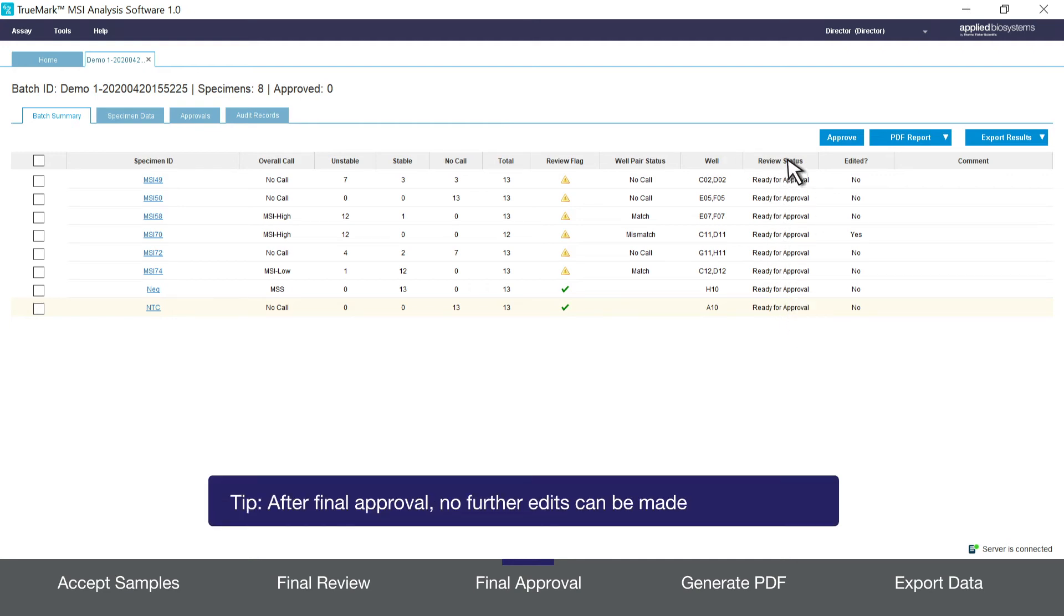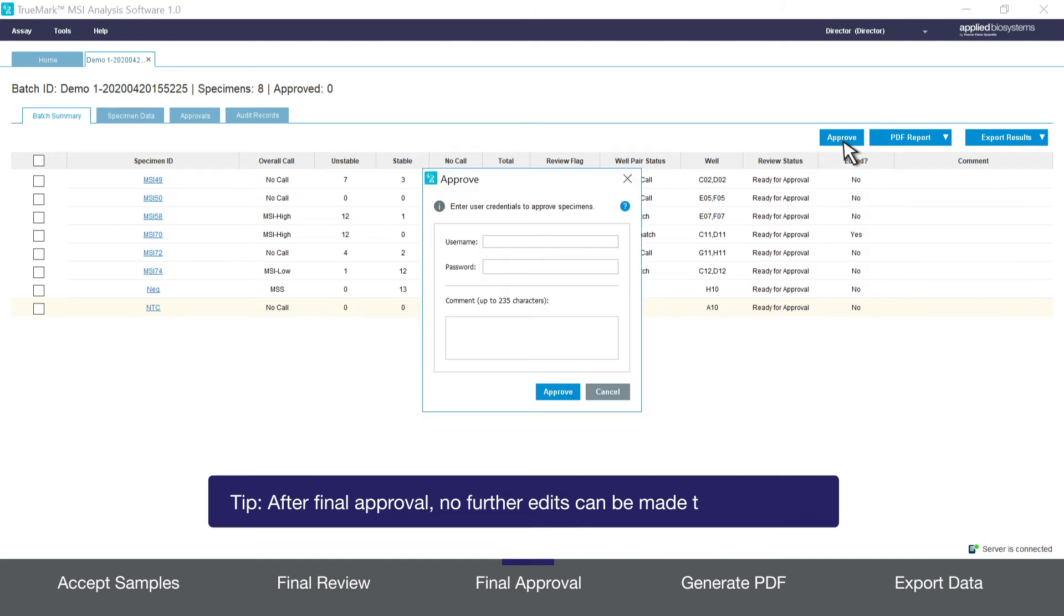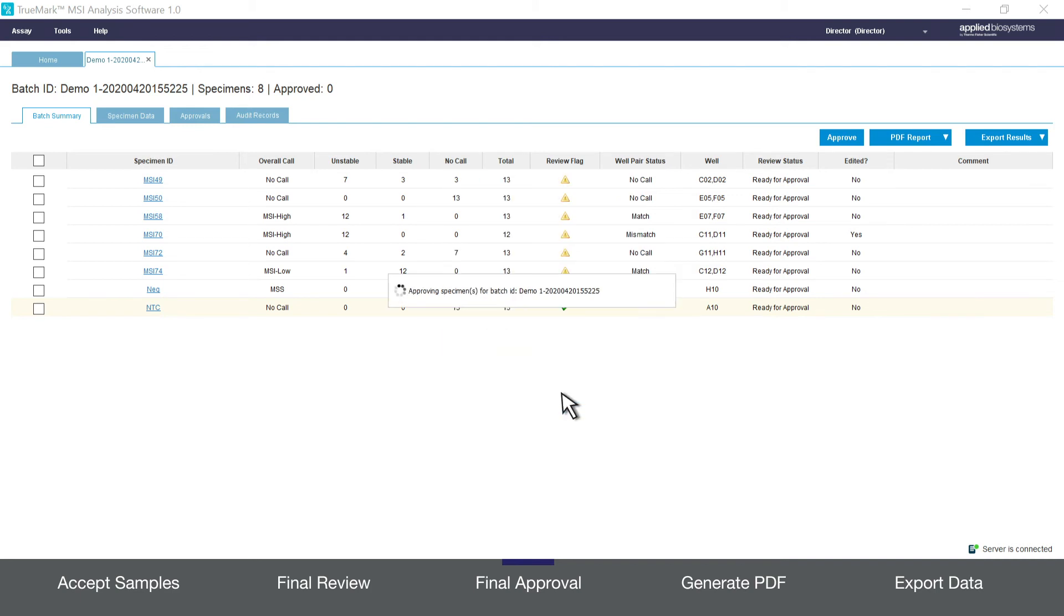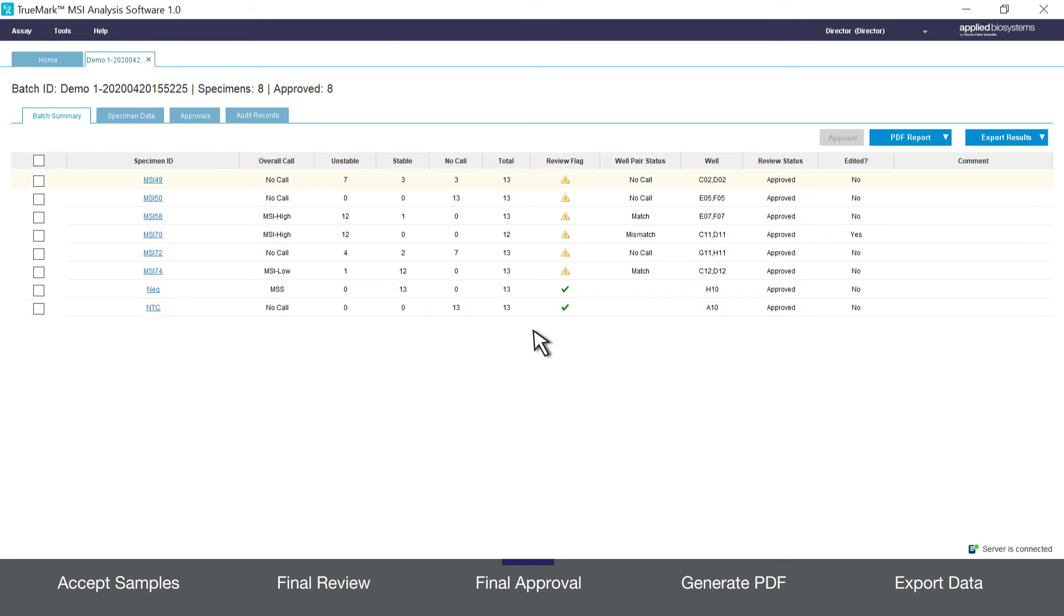To perform a final approval of all click on approve in the top right. A dialog box opens asking you to provide your username, password, and any additional comments. Fill that in and click approve. Once complete you'll see a note that says specimens approved successfully. Click OK. Now you can see that the review status column of all samples states approved.